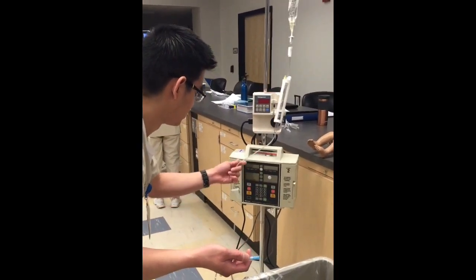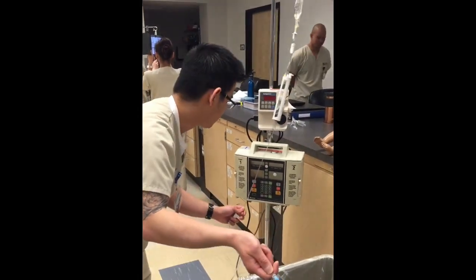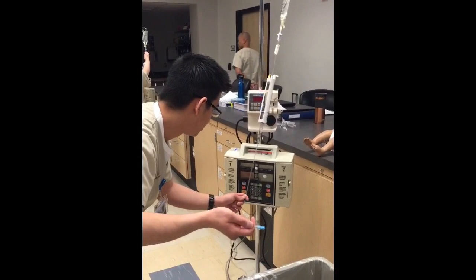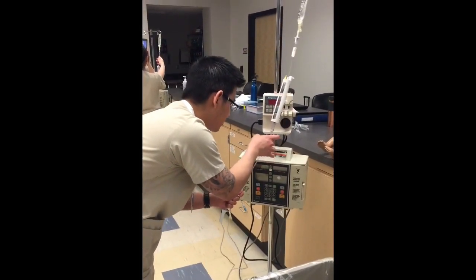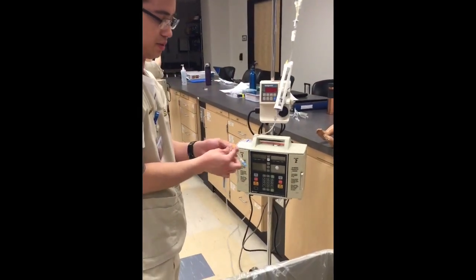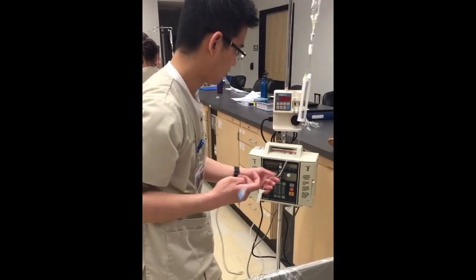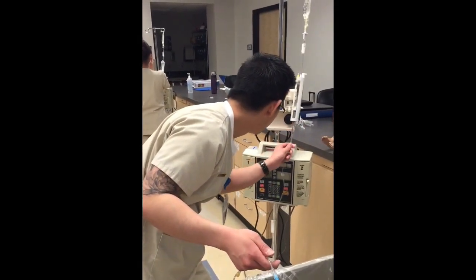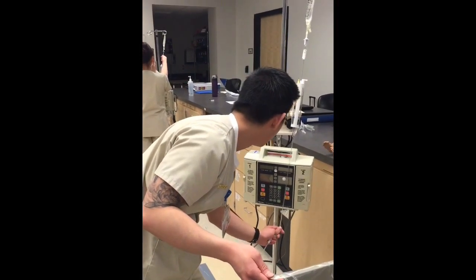You should already do this — just follow the fluid flow. If there are bubbles, strip the tubing. You can also use a syringe to take the bubbles out, but just wait until it starts pressing. It's sterile.